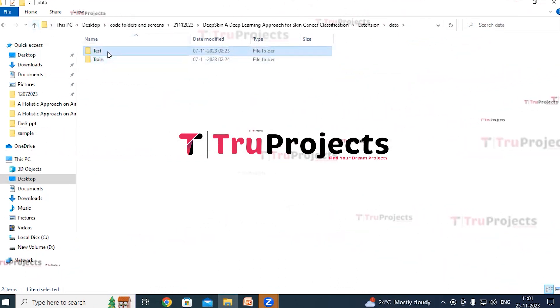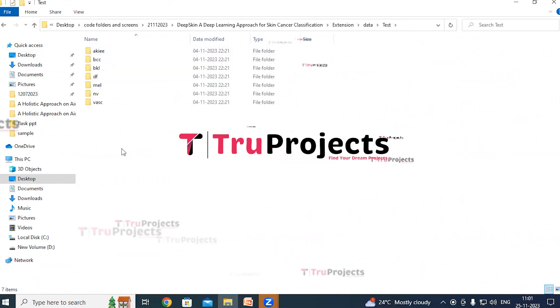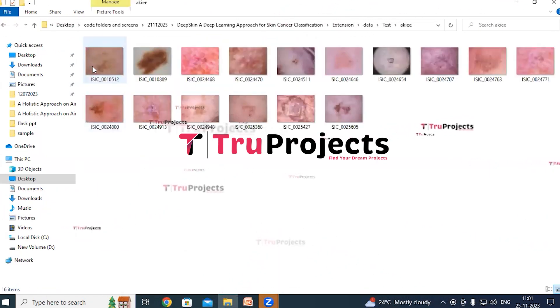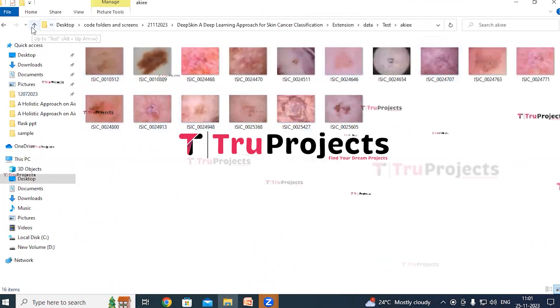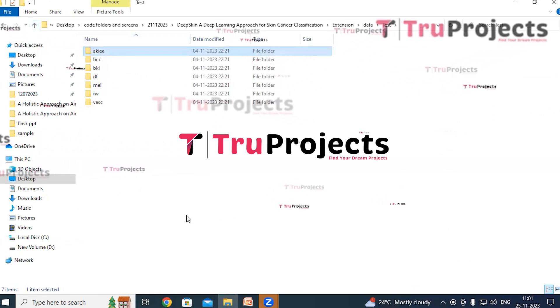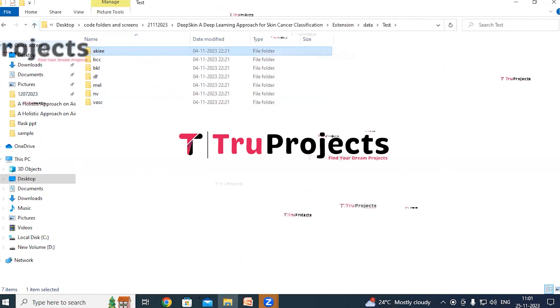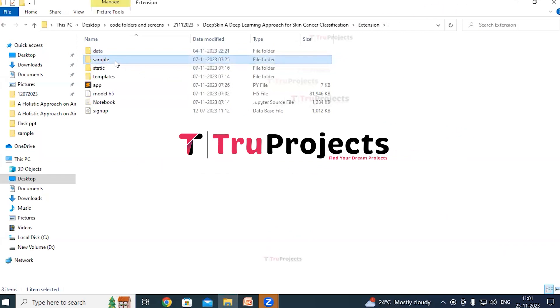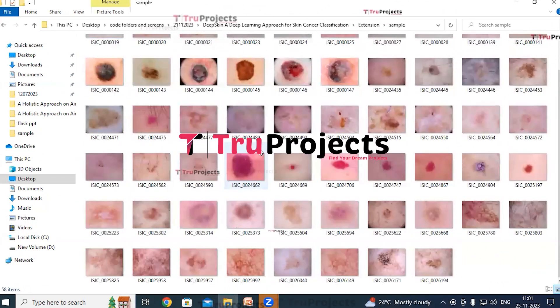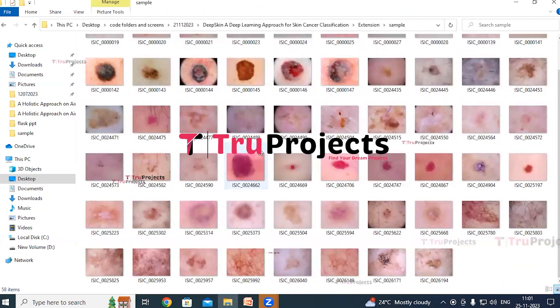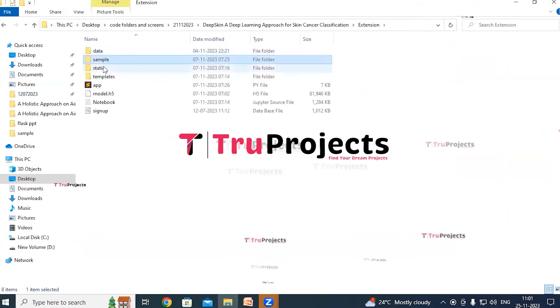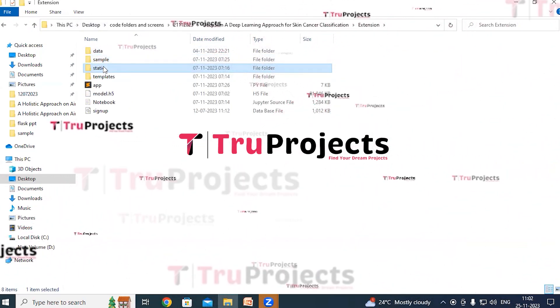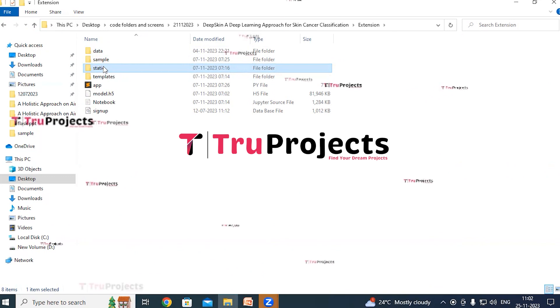In the test images folder there are again seven different class image folders, and these images will be used to evaluate the performance of the trained models. A sample images folder contains images that will be used in the application later. The static folder consists of files related to CSS, JavaScript, and Bootstrap.